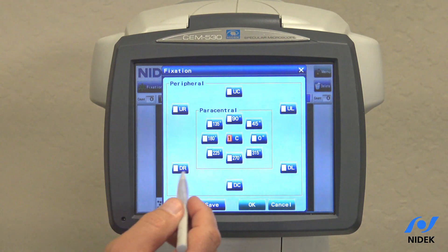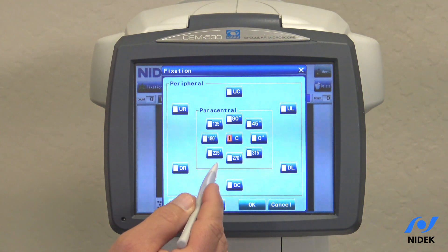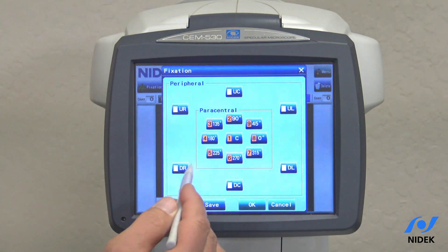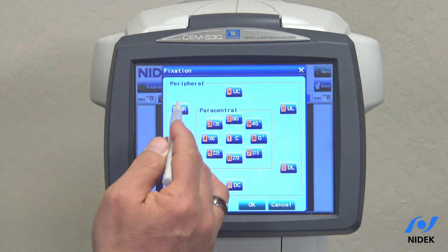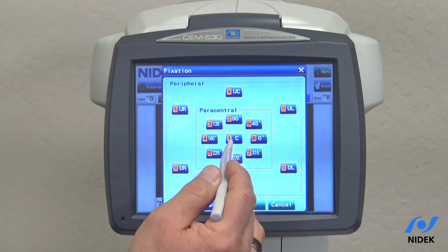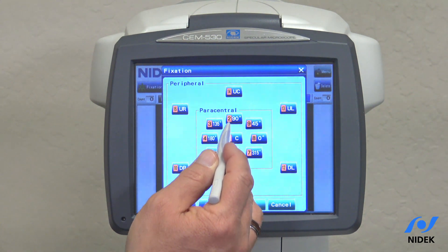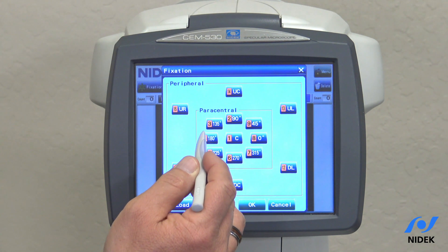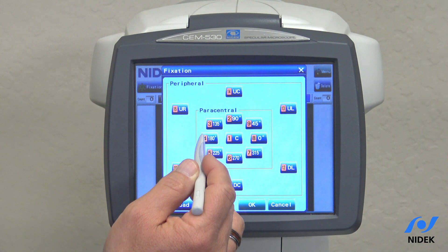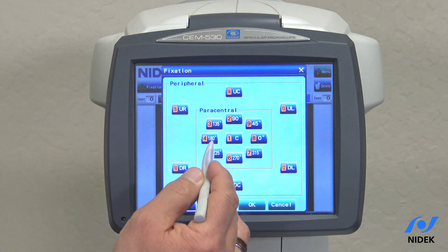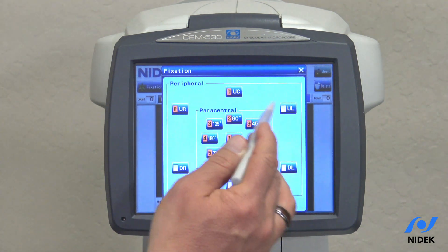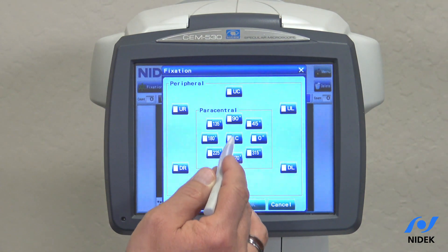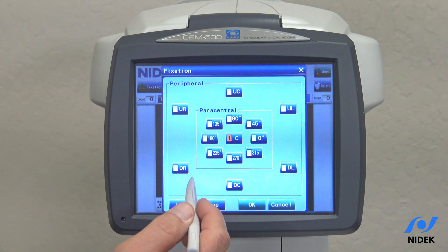With the CEM530, we're able to acquire endothelial cell images from central, paracentral, and periphery. The device itself will automatically move from number one to number two, number two to number three, and so forth, depending on the patient's fixation and movement of the internal fixation dot. Not all of these need to be selected.